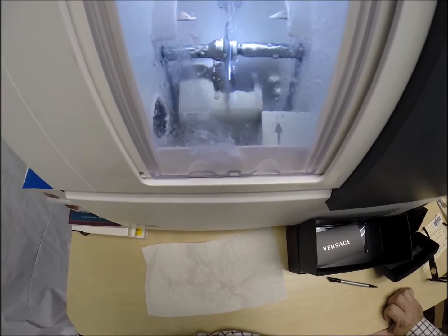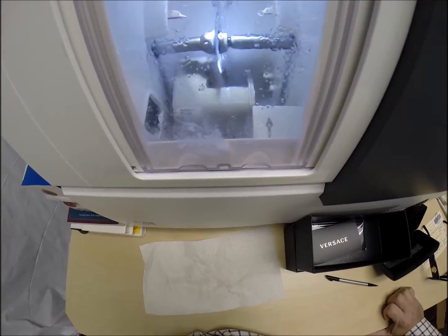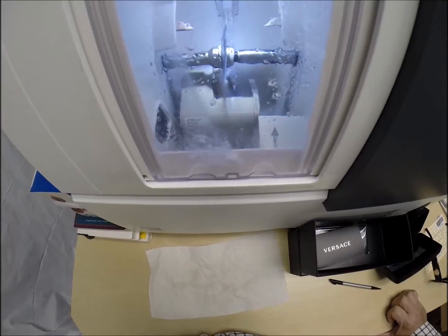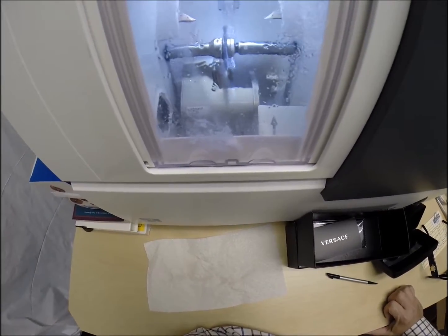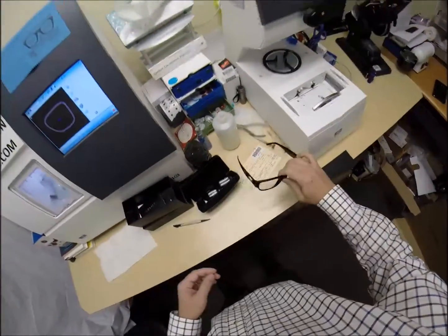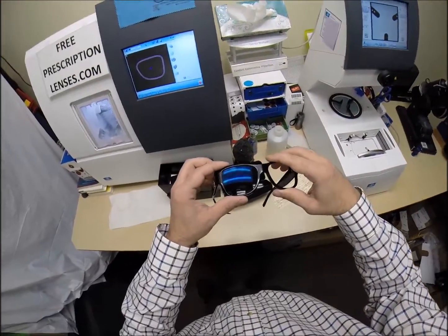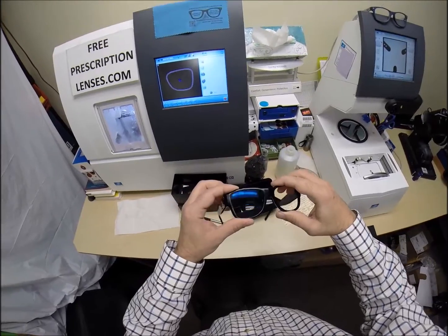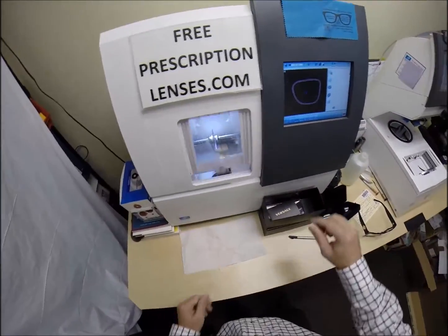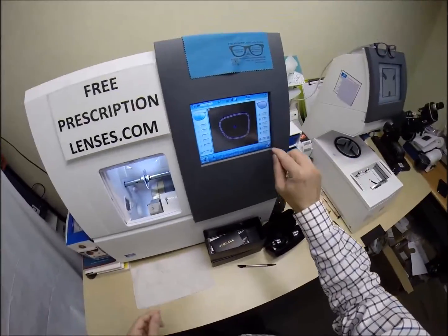But there's all different layers of Crizal coating, Crizal Easy, and of course, the longest time, Crizal Alizé and Crizal Avancé, which was advertised as the clearest. And then came Crizal Prevencia, which has the blue blocking ability. And then the Crizal Sapphire, which too does block some of the blue light, not as much as Crizal Prevencia. Of course, the transitions block about 30% of the harmful blue light, and you got the Crizal Sapphire on top of that, blocking even more.